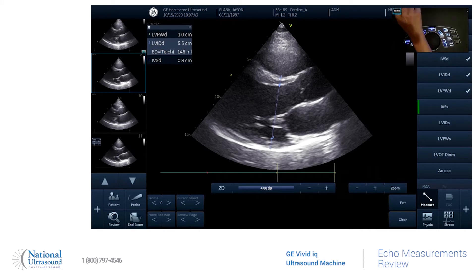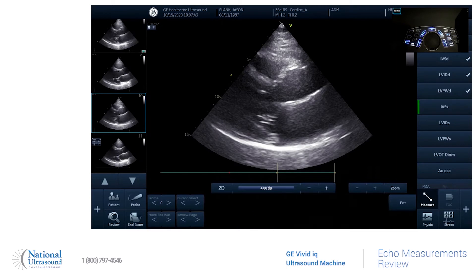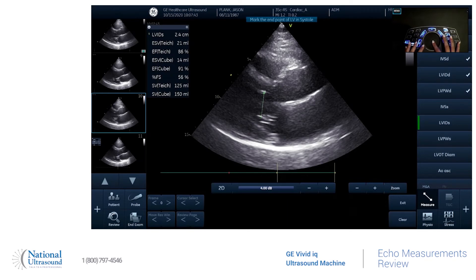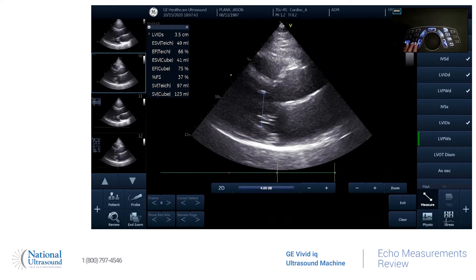And then if we want to measure in systole, go back to measure. Set that and store that. And it's going to give us obviously our EF.